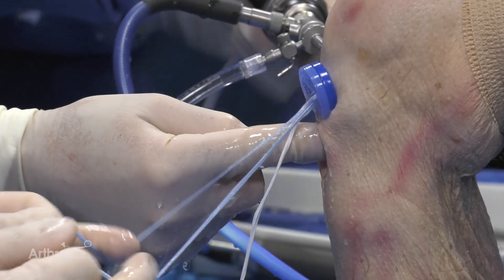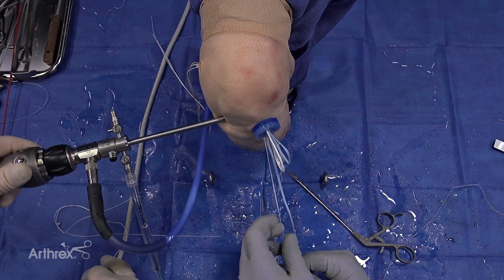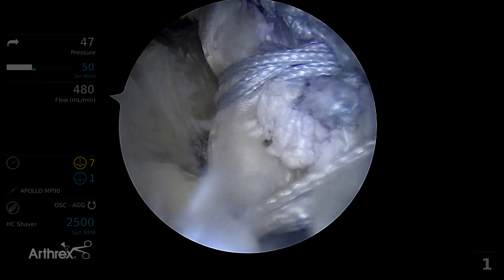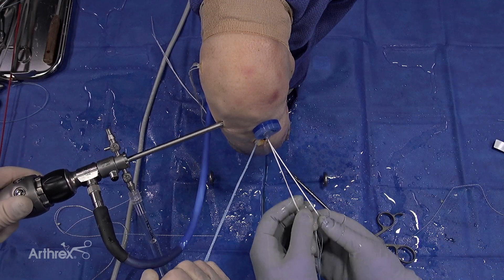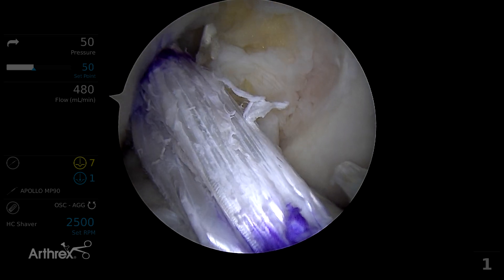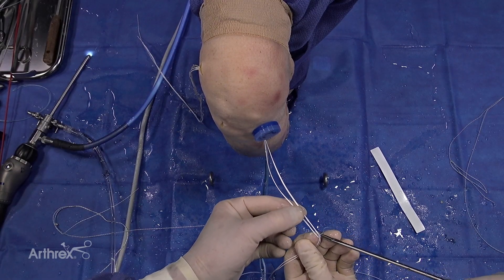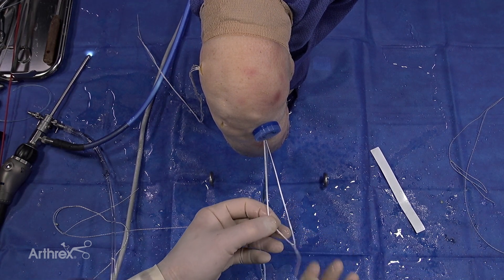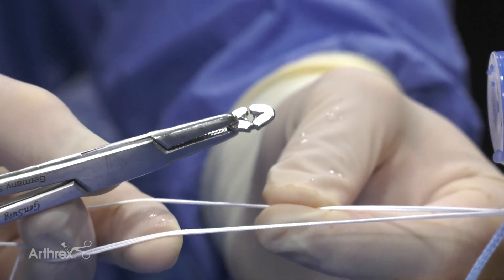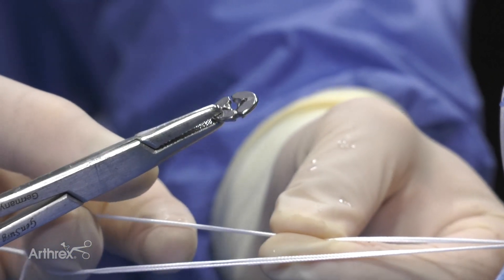The next step is going into the tibia. An important point here is you never pass the loop alone — we always put a shuttle suture to protect the loop. We're going to pass the two ends of the tape and the shuttle suture for the tightrope no-button loop into the tibia. We deliver the two tapes and the tightrope no-button loop out the tibia, and the graft passes. There's our graft going into the tibial socket — right on our numbers, 23mm into the intra-articular distance. Graft is in good position. Now we're going to apply the ABS button — the attachable button system — to the no-button loop. This is a 14mm diameter button, perfect for the independent internal brace, with two accessory holes to allow separate passage of the tapes.